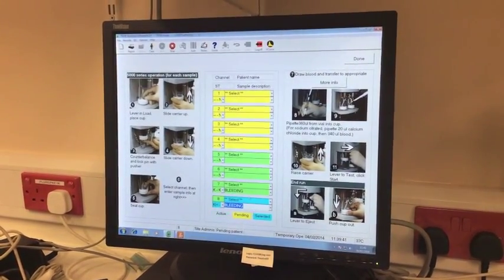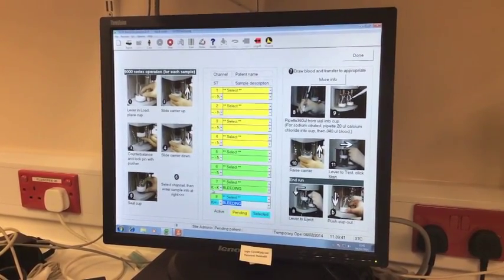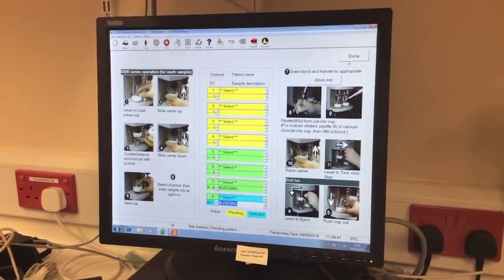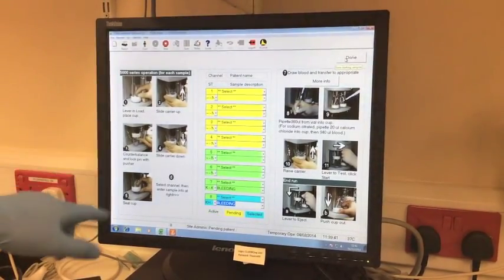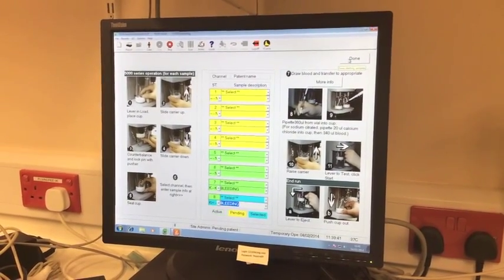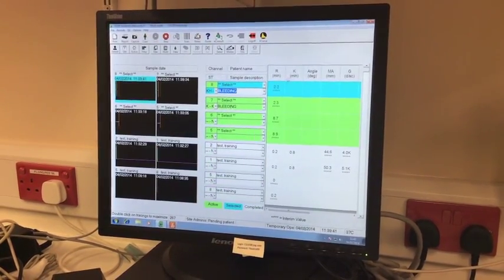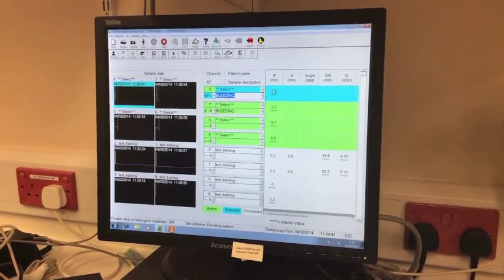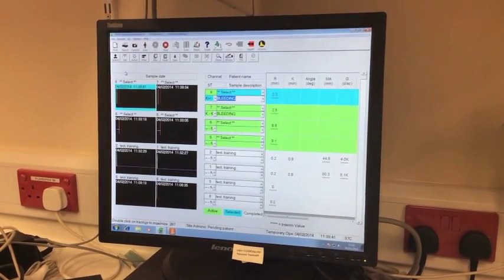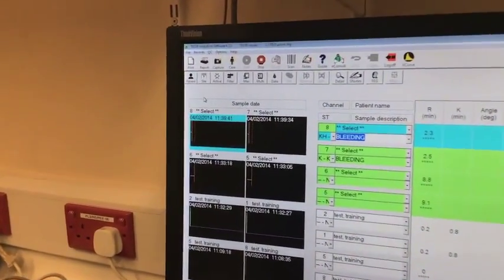So we've started our traces, selected the patient details, put in the type of trace that we're running, and given a little bit of demographic information about the operation. We then click Done, and you can see on either side of the screen is information about how to run the test as an aide-mémoire. We click Done, which takes us to the main screen, whereby we start to get our results of our TEG as the traces develop. This will develop over the next few minutes to hours, depending on what we're looking for.